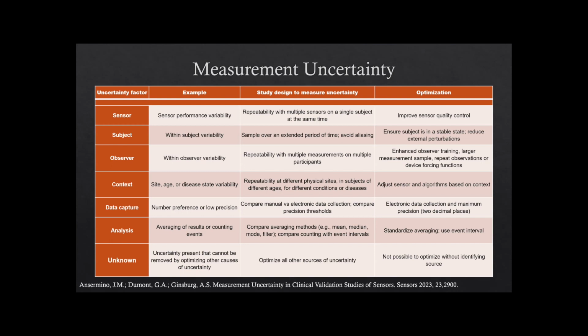It could be the subject, and obviously skin tone is one thing, but there are lots of other things. I deal a lot with newborns, and there's no doubt that age is a huge factor when you look at the accuracy of pulse oximetry. This has nothing to do with the device. It has to do with the fact that oxygen saturation varies breath to breath as the child becomes relatively hypoxic between breaths.